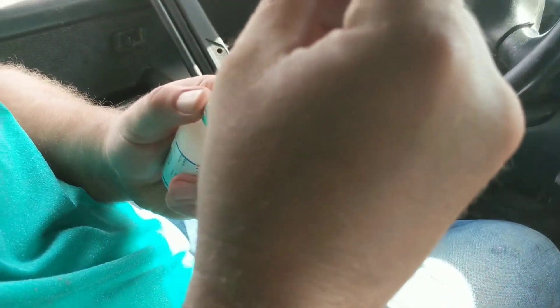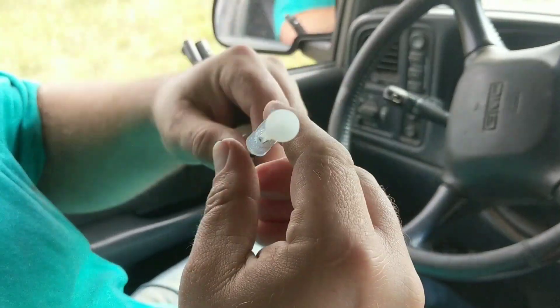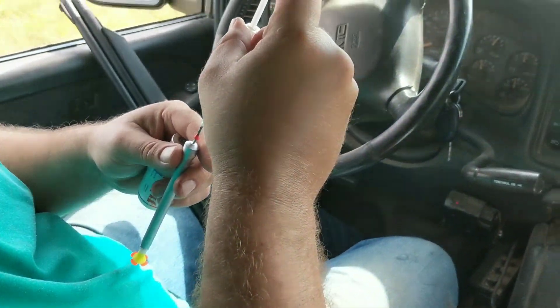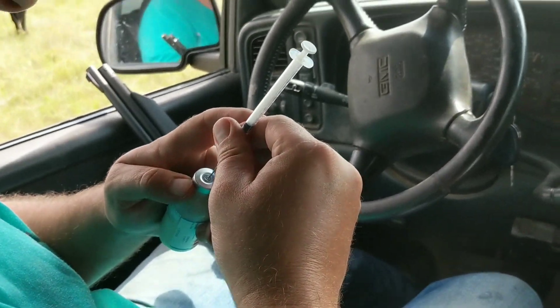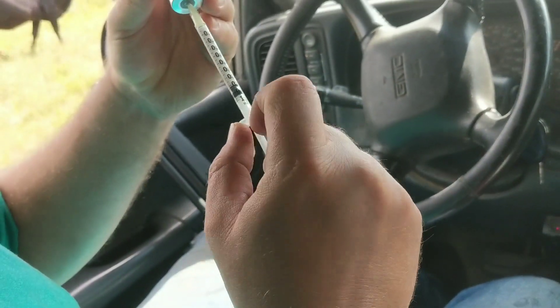I need 5 cc's and this is only a 1 cc syringe that I've got here because I couldn't find one that this little needle would fit on. 1, 2, 3, 4.